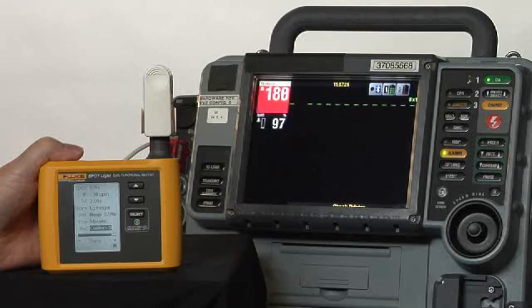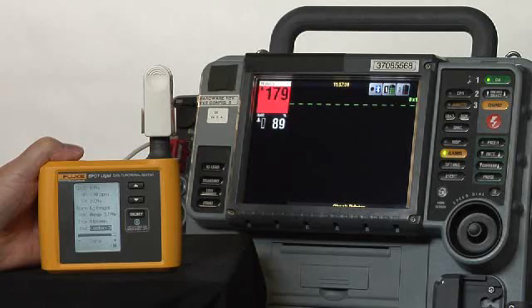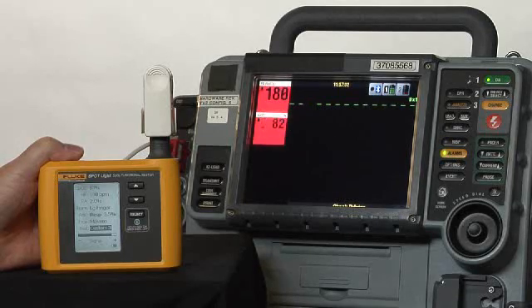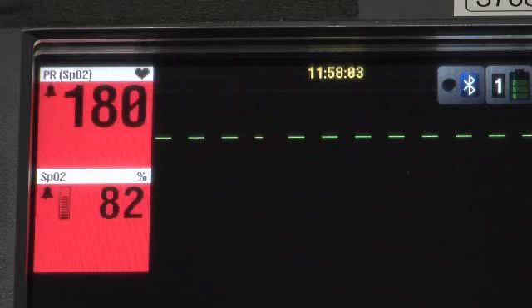You can see it sets off the high-limit alarms, which is exactly what we want it to do. We'll watch till the oximeter reading and the heart rate settle.